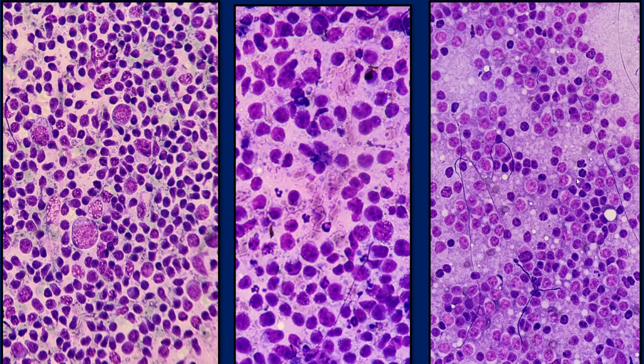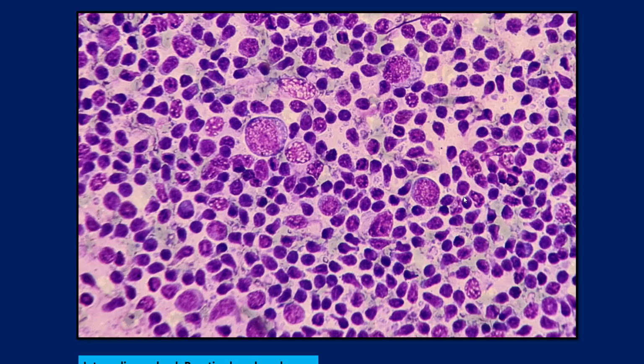Now, this case again is something I've shown you before is a problem, because the population is not really polymorphous, it is not really monotonous, it is a mixture of cells. There are small lymphocytes, but a large number of intermediate cells, some cells with clearing of cytoplasm, who knows? So this was a reactive lymph node, a diffuse large B-cell lymphoma, and this turned out to be a marginal zone lymphoma.